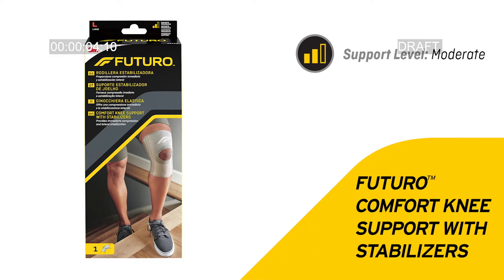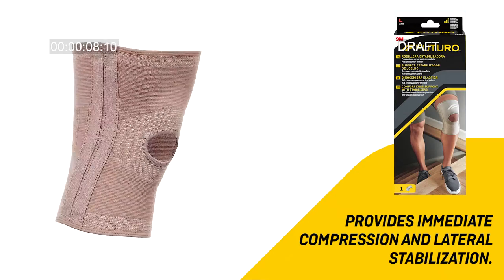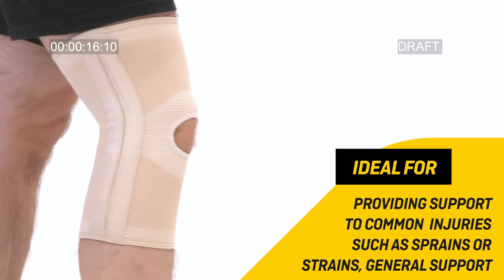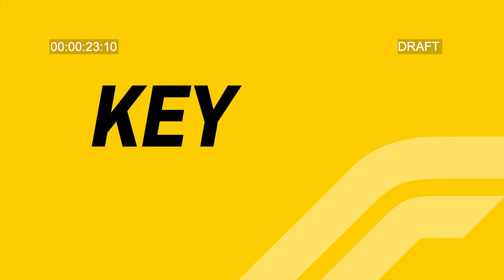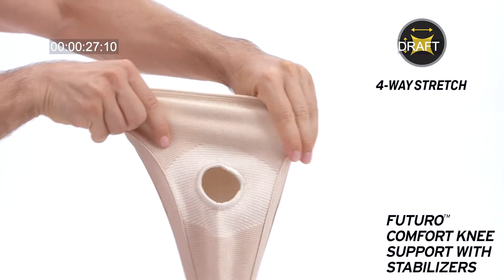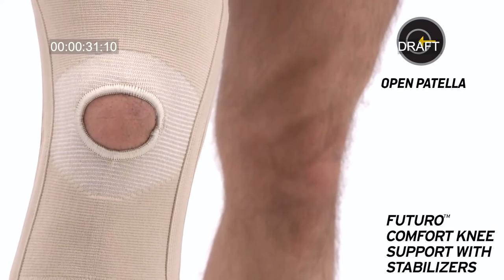Futuro comfort knee support with stabilizers provides immediate compression and lateral stabilization, ideal for providing support to common injuries such as sprains or strains and general support. Four-way stretch material keeps support in place, with an open patella for kneecap support.